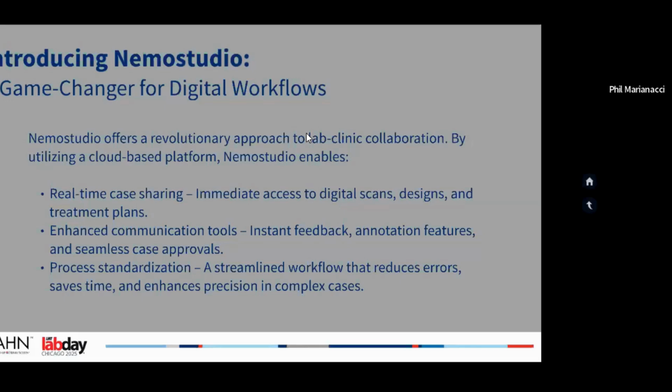And so you might be thinking, what is Nemo Studios? Is it just implant planning software? Or does it have other functions that entice the doctors to get it, and then therefore we want to integrate and make guides and communicate? And that's essentially what it is, and a whole lot more, but that's essentially what it is at its core.